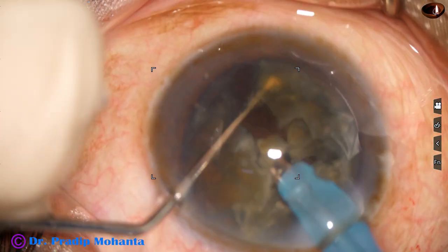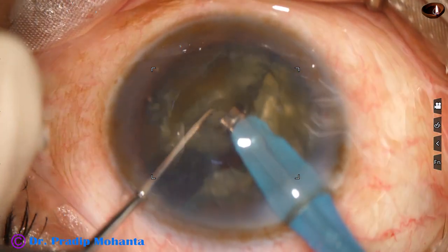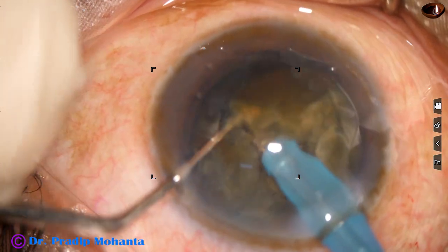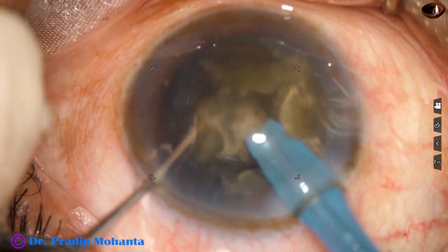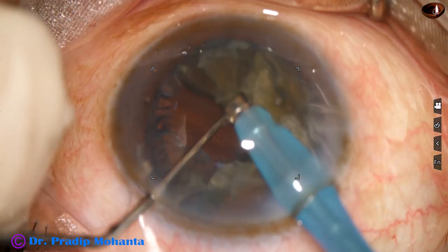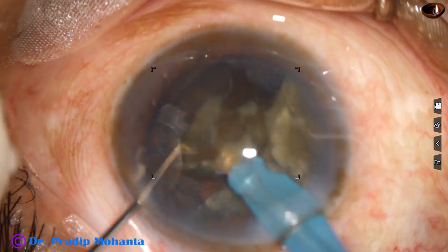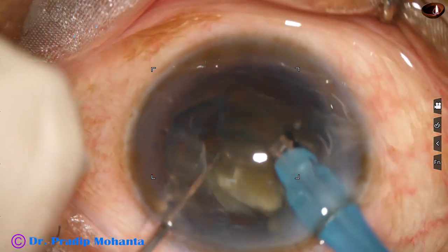Then one hemi-nucleus is chopped into two fragments. Moving to the other hemi-nucleus, it is also chopped into two fragments, so we have got four fragments. Now each fragment is tilted and emulsification is started from the apex of this triangular nuclear fragment.